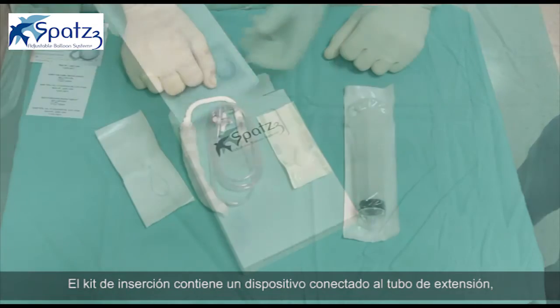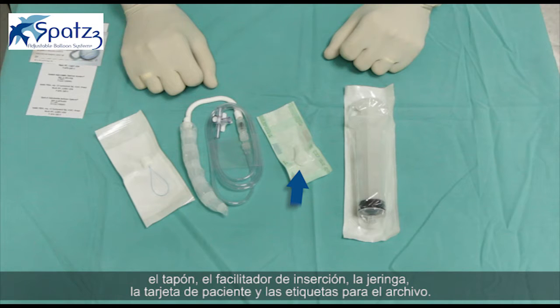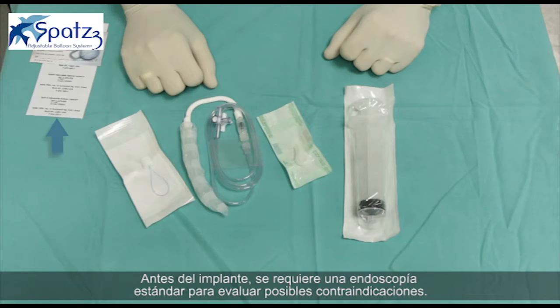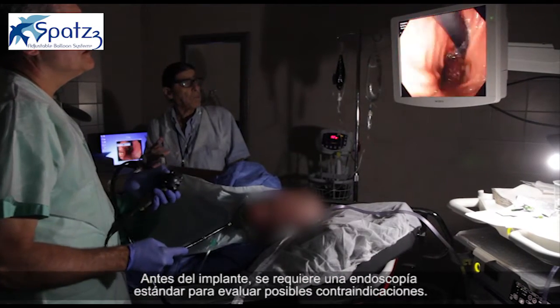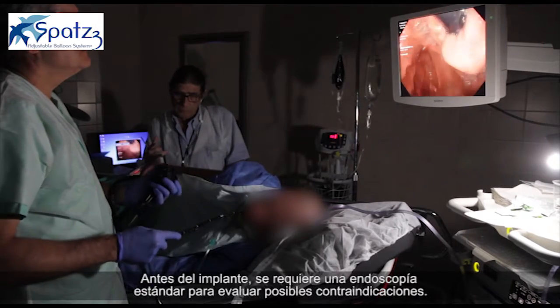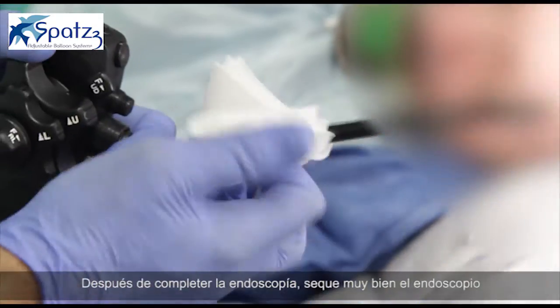The insertion kit contains the device connected to the extension tube, the provided cap, the insertion facilitator, the syringe, patient card, and chart labels. Prior to implantation, a standard endoscopy is performed to evaluate for contraindications. After completing the endoscopy, dry the endoscope thoroughly.